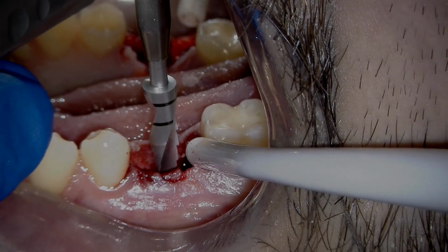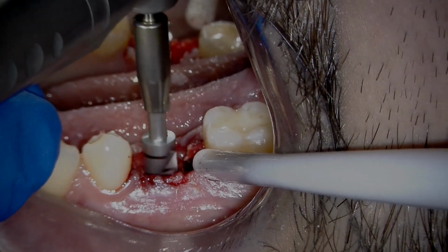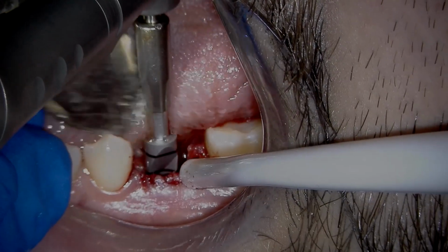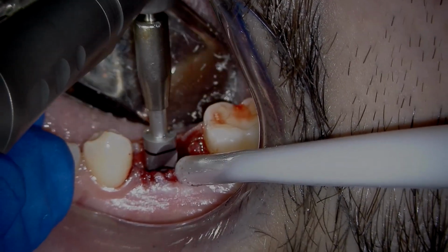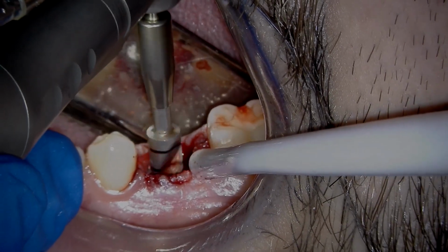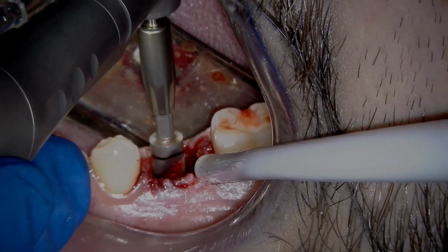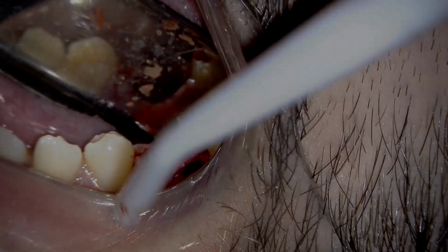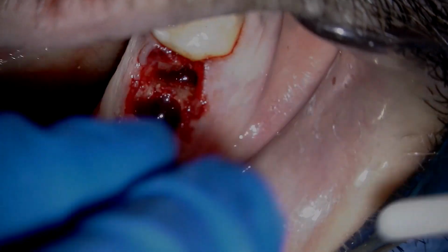This is the multi-drill. The multi-drill is going to follow the pilot hole of the parallel drill. And again, in this, for instance, I am going to take it down to full working depth. So I'm going to advance it just a little bit more. There we go. And it is that quick to create an osteotomy.